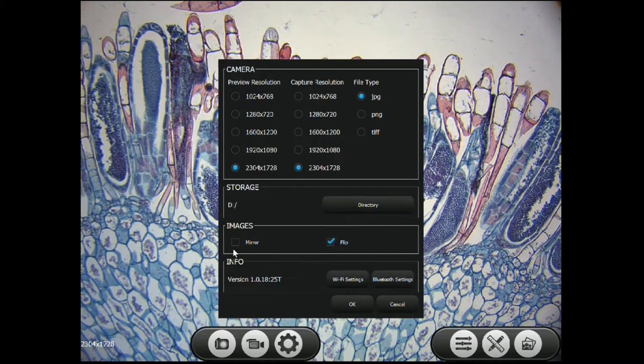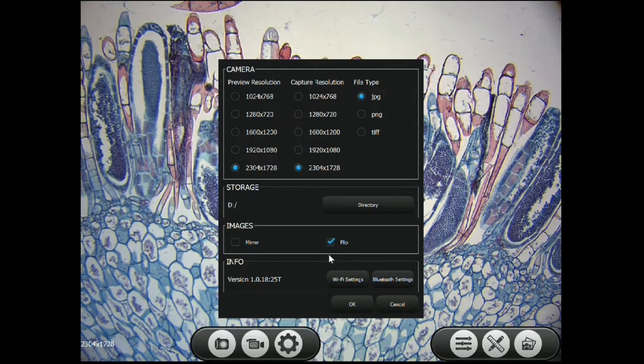You can use these settings to mirror or flip the image to match the image in the eyepieces. Down here are your Wi-Fi settings and your Bluetooth settings.